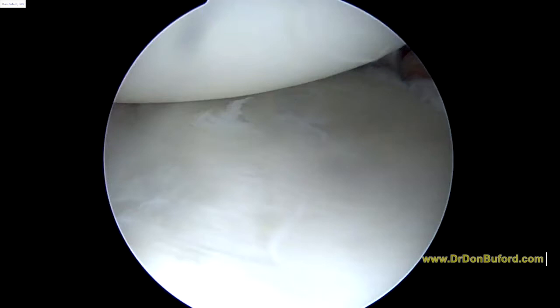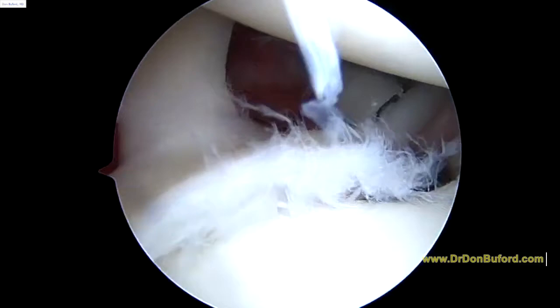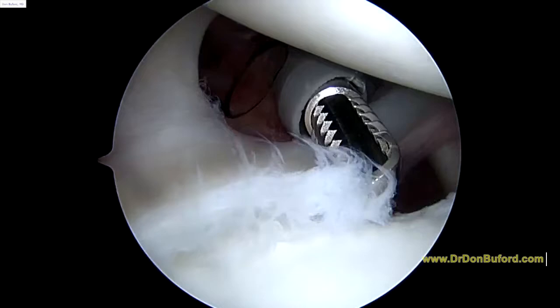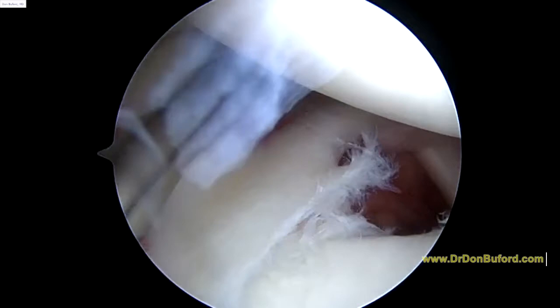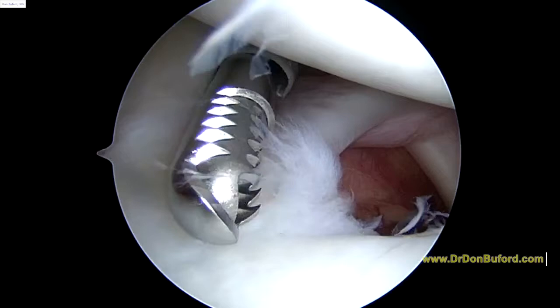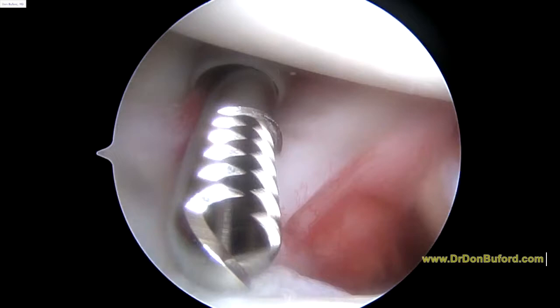But you still have this SLAP lesion to worry about. So we're going to look from the back to the front — and you can see we've still got this issue here with the biceps anchor region, what we call a type 2 SLAP. So we're going to go ahead and lock down the cannula on the shaver and clear a little bit of debris on here so we can see exactly what else we need to do.